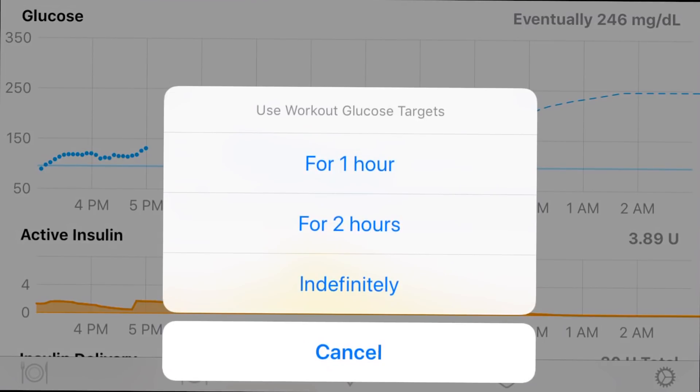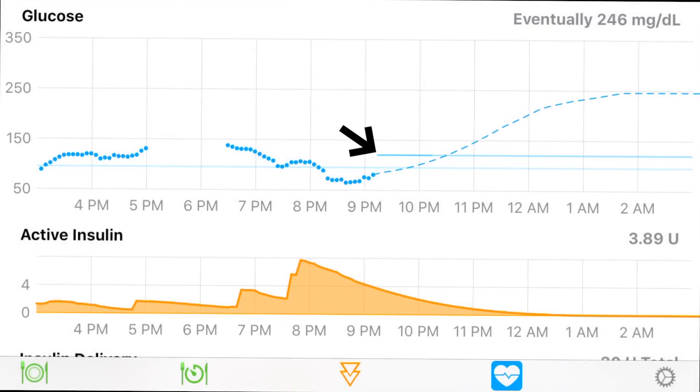And then this is exercise. Right now my target's at 140 for one hour, so that's what the system will try to bring me towards — instead of trying to reach 95, it's going to bring me up to that 140. What's really fascinating is that I get to choose what all these numbers are. I can't stress how important that is for our community. You can set your target to 95, 100, 120, or 140 — whatever you want.